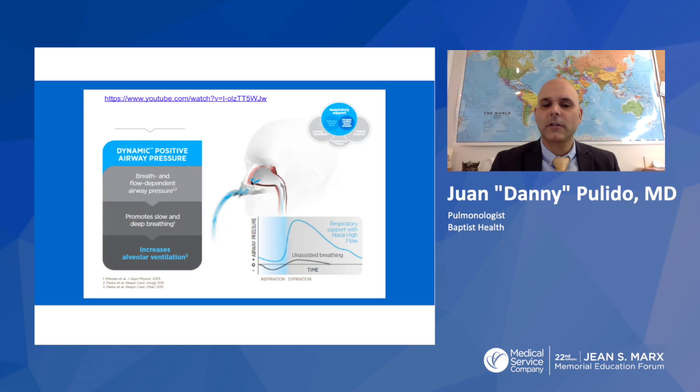But what they have been able to figure out over the years is that the heated humidified component actually helps moisturize that airflow. And what we found is a variety of things. It helps alleviate sinus congestion and a lot of the sinus issues. It helps patients with postnasal drip to clear chronic sinus scenarios. And from an overall airflow standpoint, it helps minimize any damage to the back of their throat and the dryness that they get when they're using any other type of oxygen therapy.